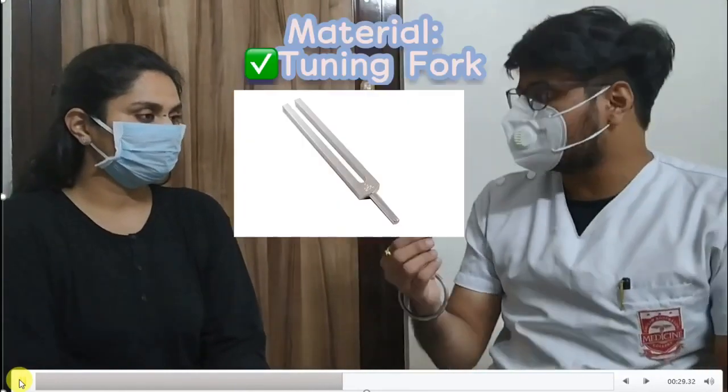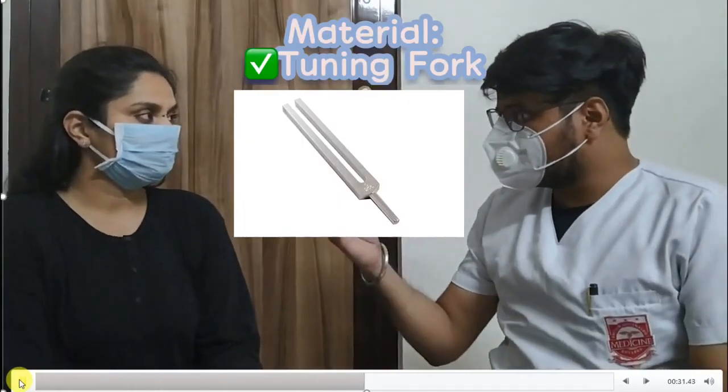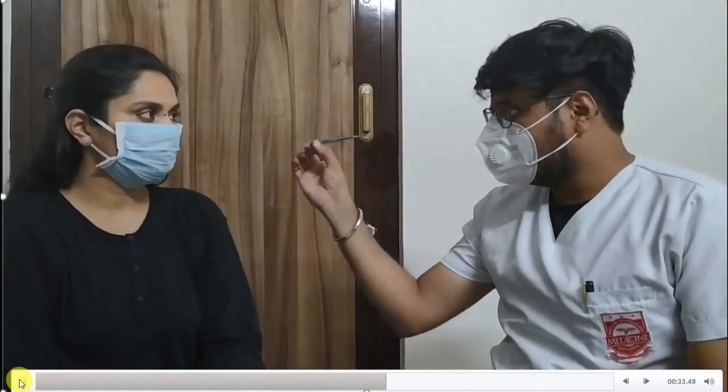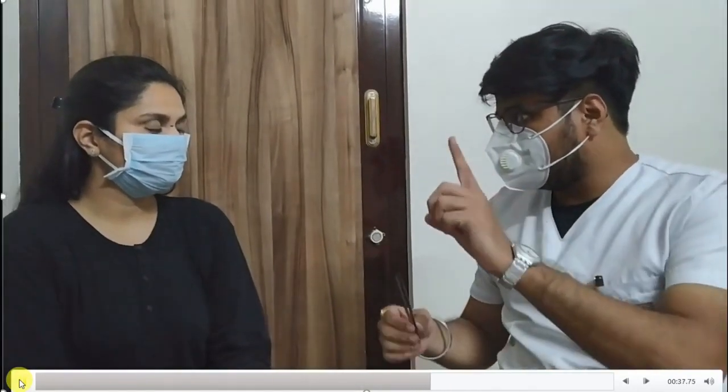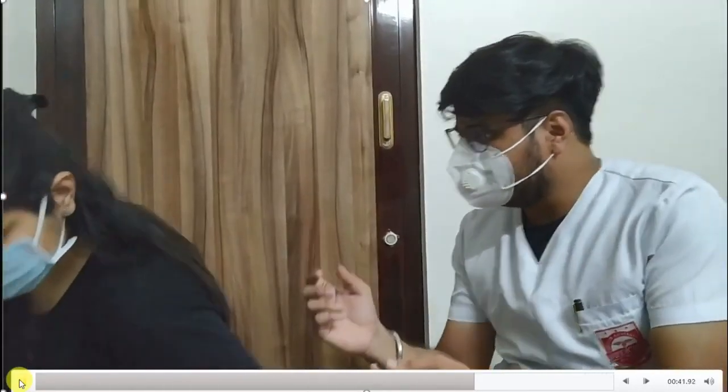Okay, so Miss Preeti, since you have hearing problem since last few months, I am going to conduct a test which is called Schwabach's test, in which I am going to use this tuning fork. I will place this tuning fork behind your ears, and when you stop hearing the sound, just raise your finger, so I will proceed further, okay? Okay sir. Okay, so can you turn to that side? Yeah, okay.